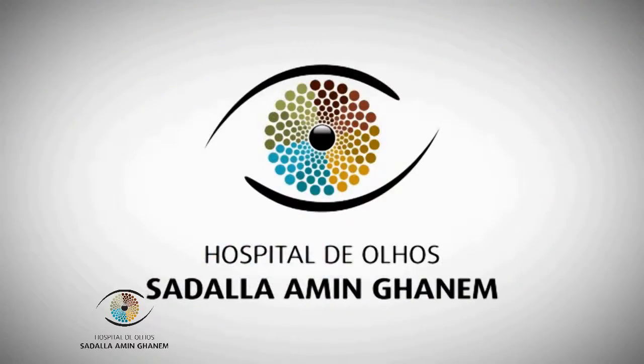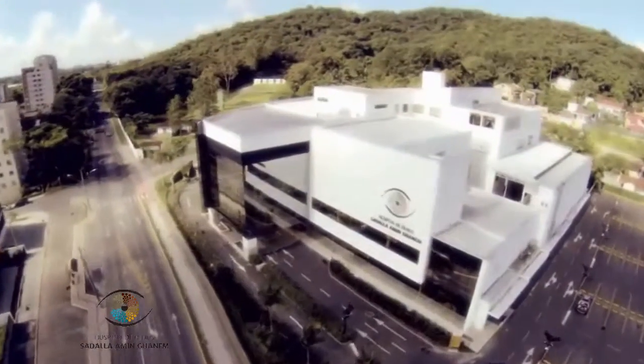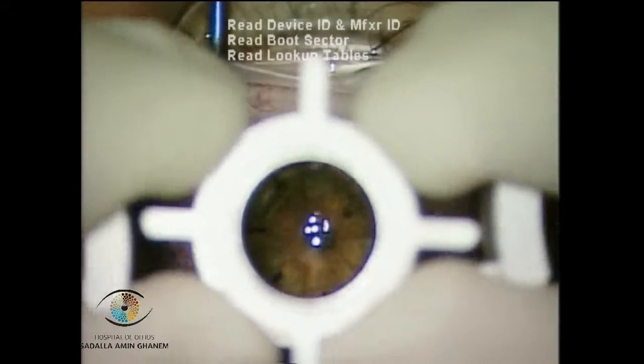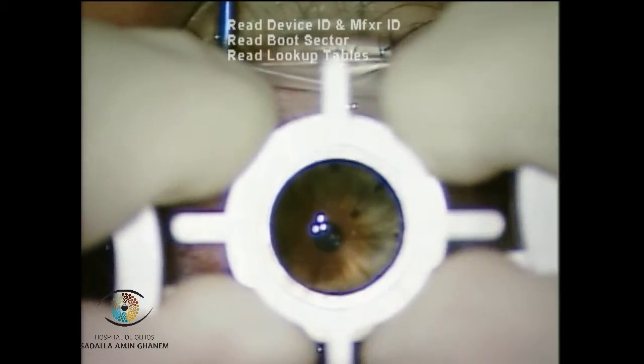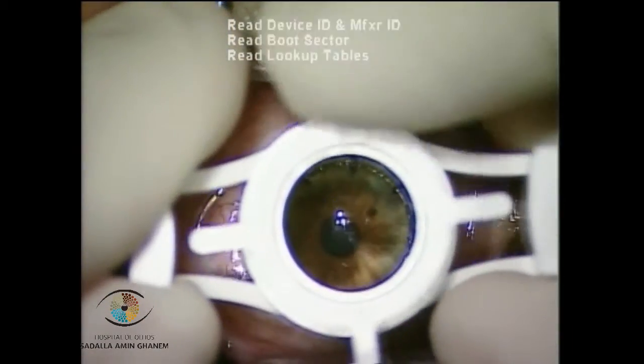Hello, this is Dr. Ramon Ganem from Sadala Mingani Eye Hospital in Brazil, and I'm going to present a case where a perforation occurred during trephanation.